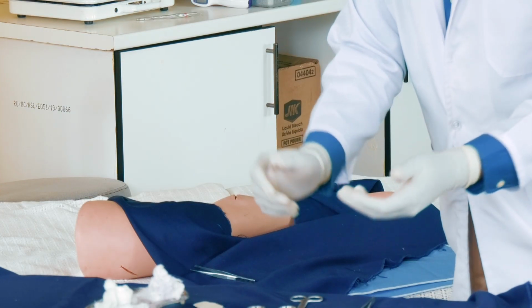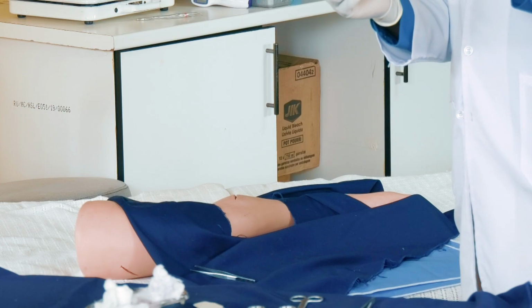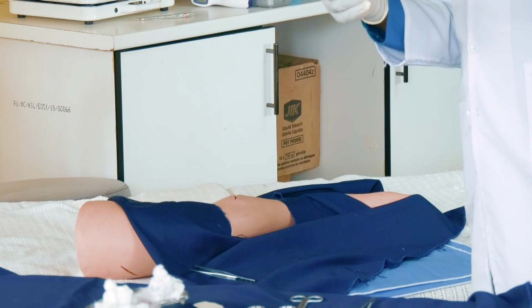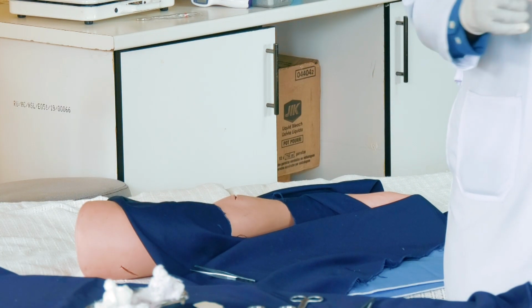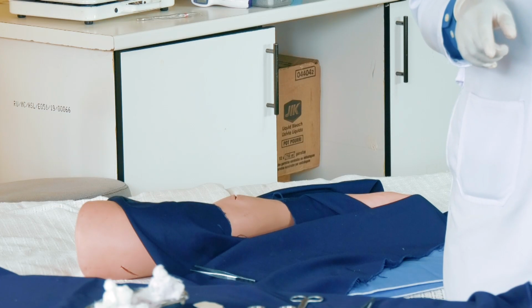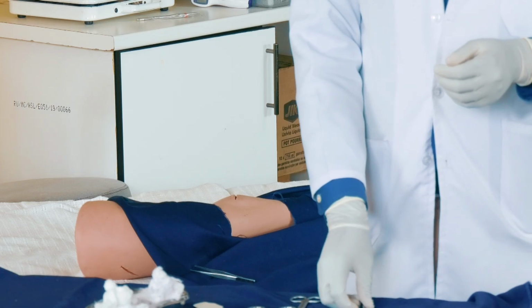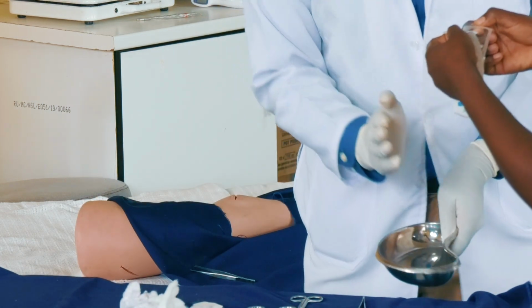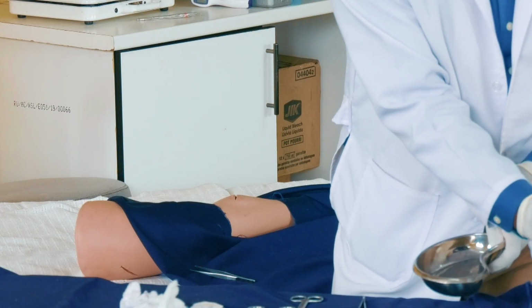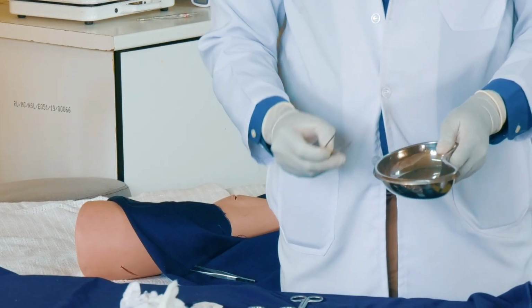Then there's something more that I need. Give me the syringe and the needle. Opening of the syringe is the same way. Get this big one. The same way you open the suture. If these are here, you don't have to come anywhere here. You stand here. Do you approach places like this like that? The way you are coming.